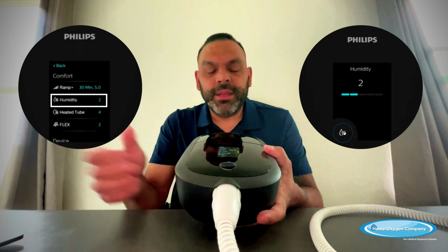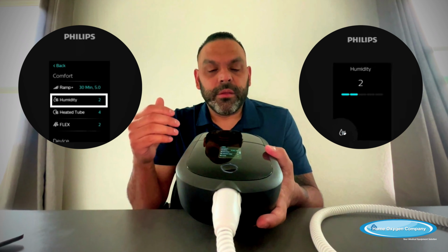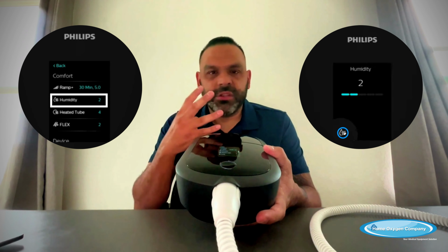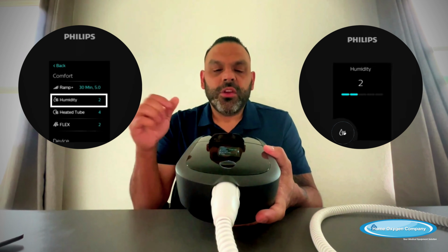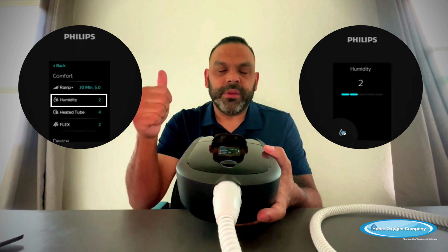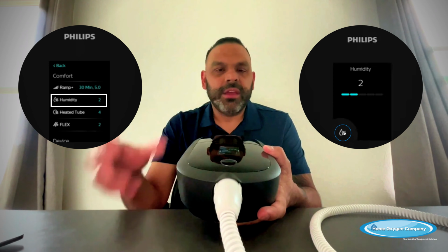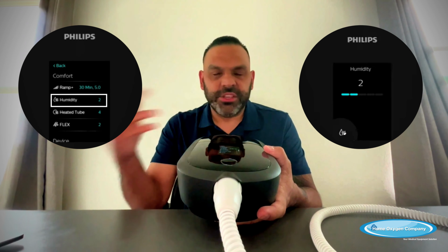With the humidity, it's for moisture. So if you feel like you have dry mouth, dry nose, it's just really dry at night, what you want to do is go into that humidity setting, turn it up to 2, see if that works for you. If you still feel like you're dry, turn it up to 3, and so on until 5.